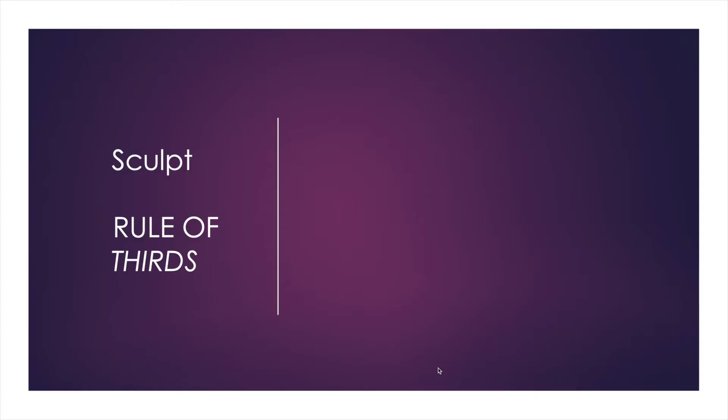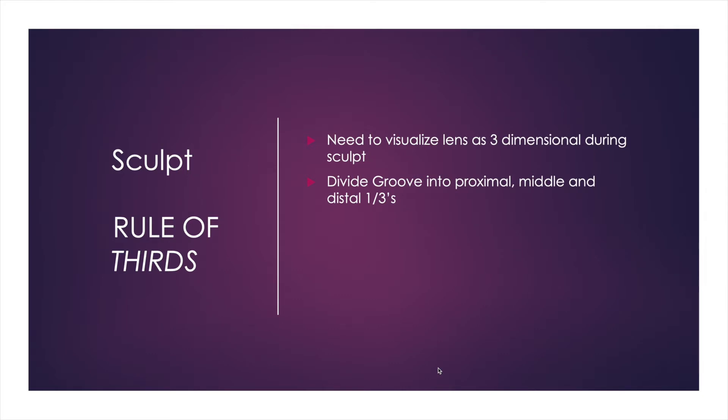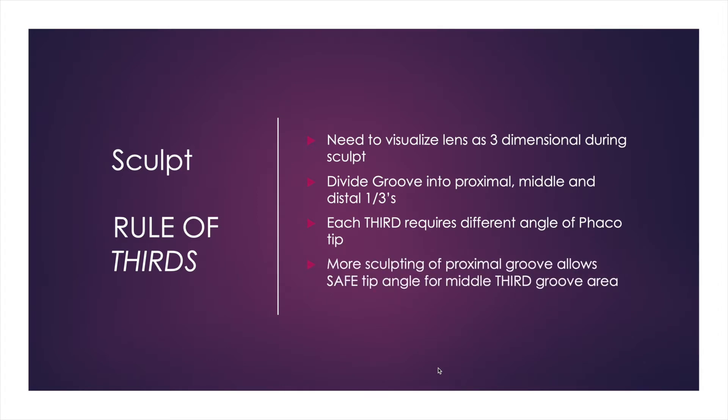I like to break the sculpting part of cataract surgery into a rule of thirds and think of the lens as a three-dimensional object that I'm sculpting. I break it into the proximal, middle, and distal thirds depending on the location of the corneal incision, and each third requires a different angle of the phaco tip because of the posterior capsule curvature.